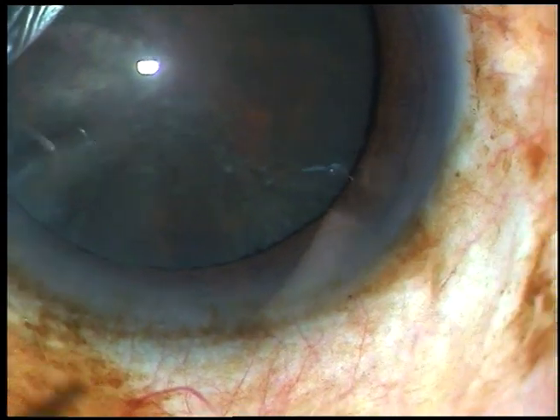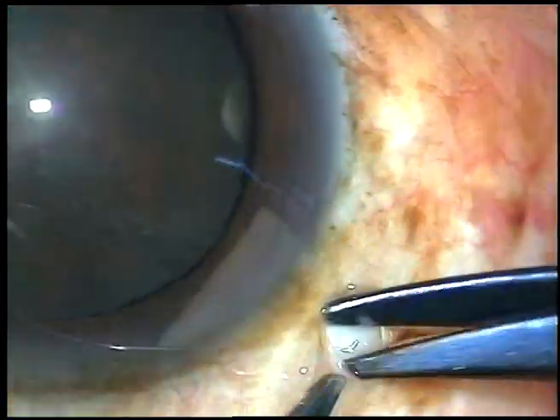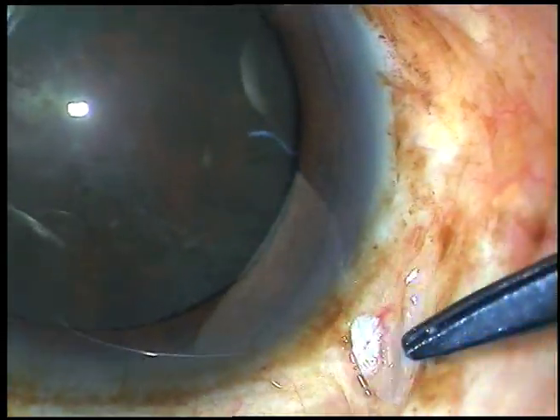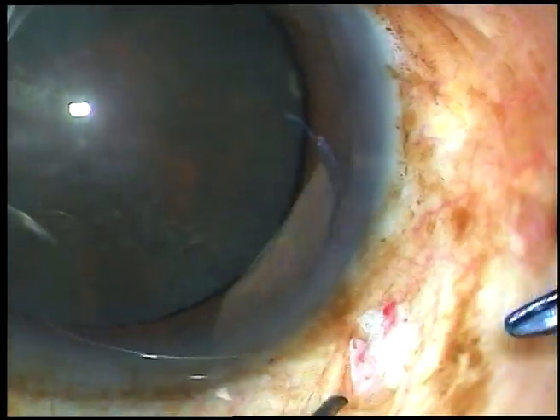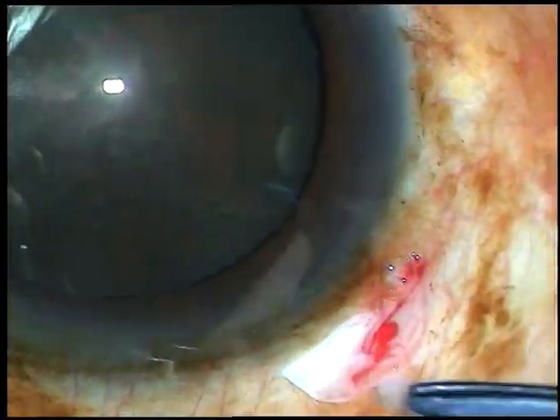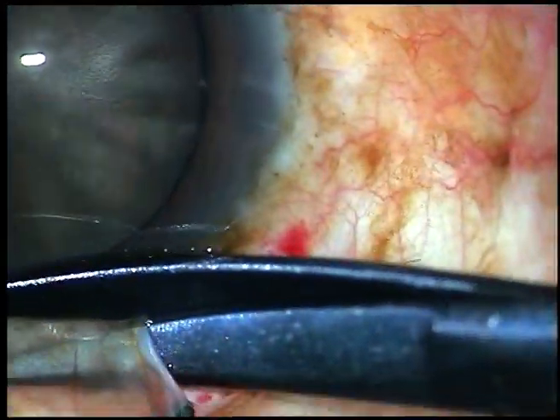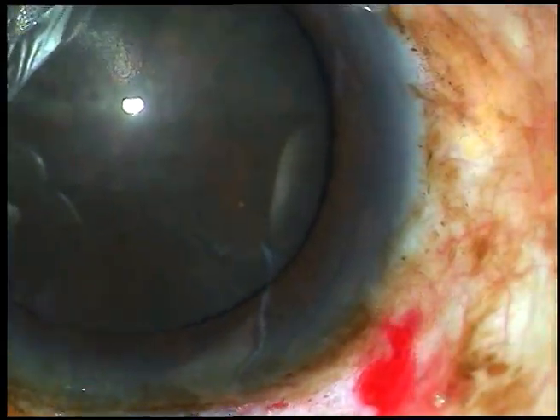Dear ophthalmology residents all over the world. This is a small incision cataract surgery. I had several hurdles in this case. Let us see how it was done and how the hurdles were overcome. Conjunctival peritomy is done for about 6 mm.